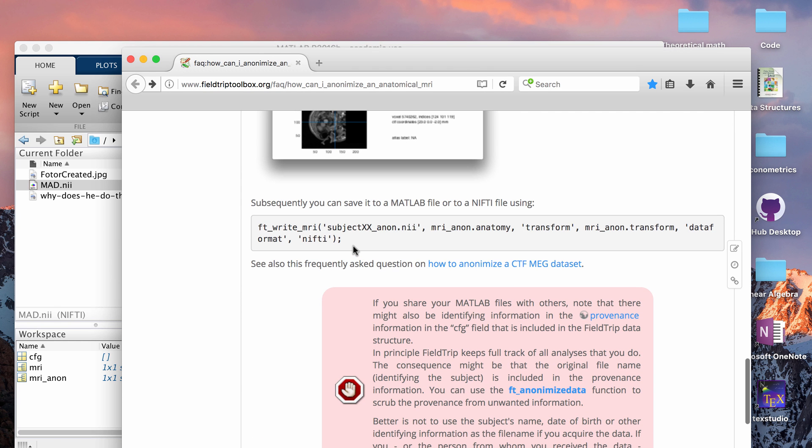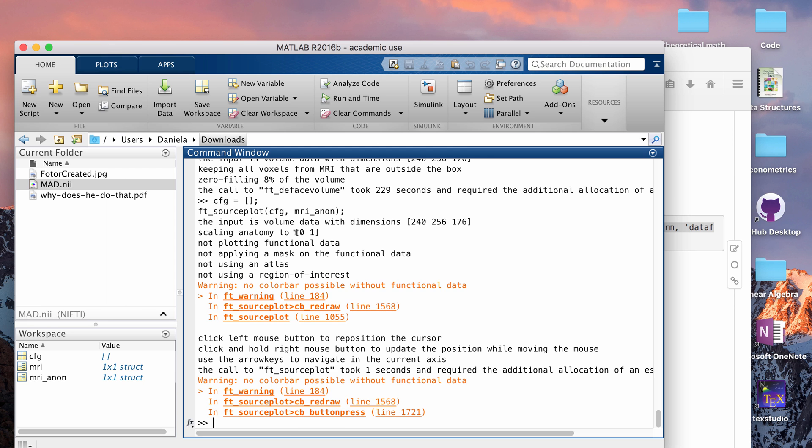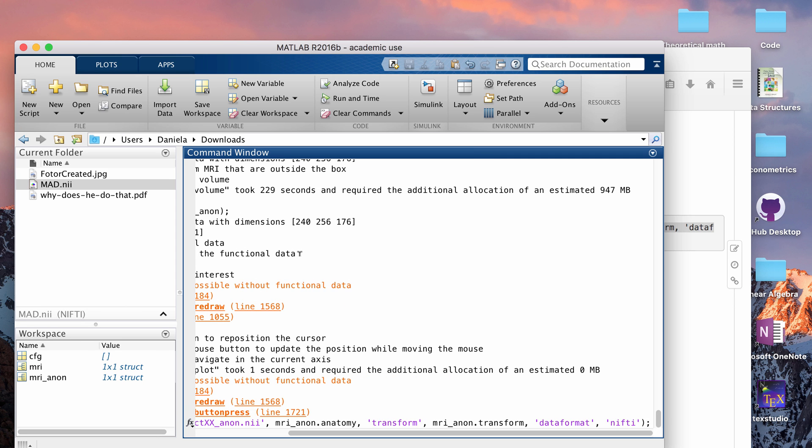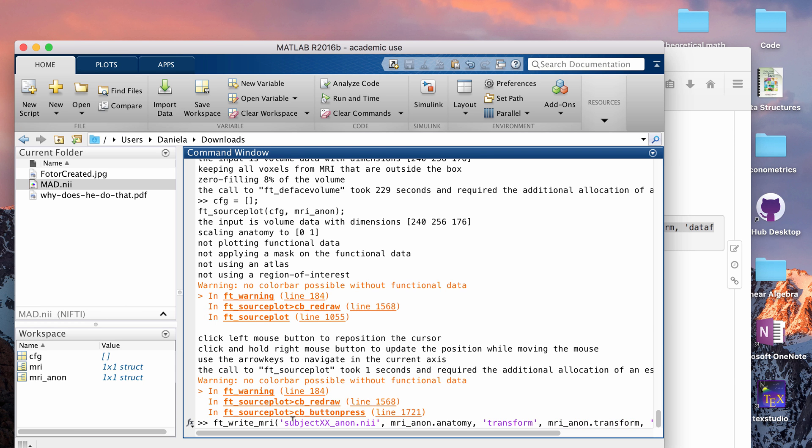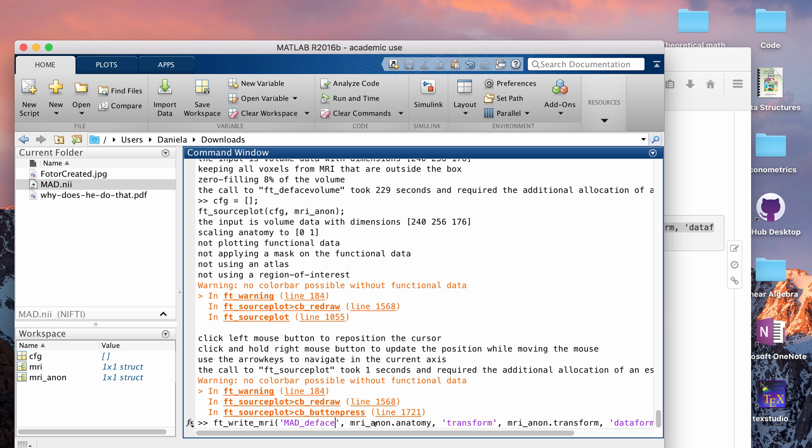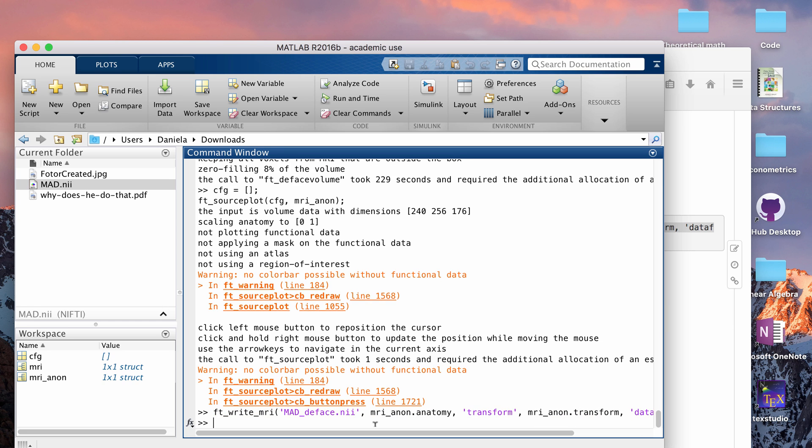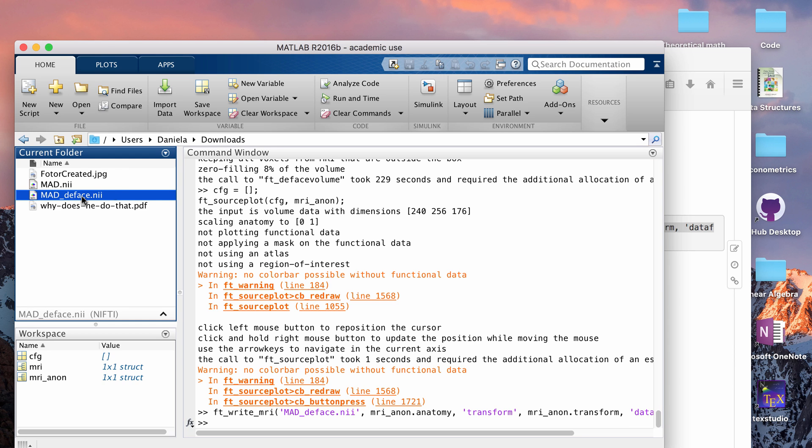And then the last line is this, where it writes it to a new nifty file. And the only thing you have to change is whatever you want to call the new file. So I can change it to mad_underscore_deface.nifty, click enter, and that will write it into your folder. So you now have a defaced nifty.